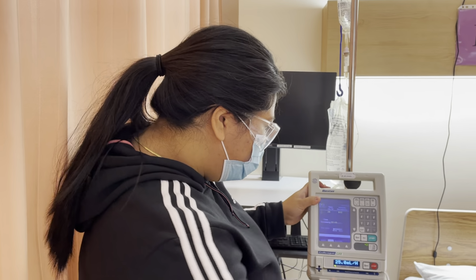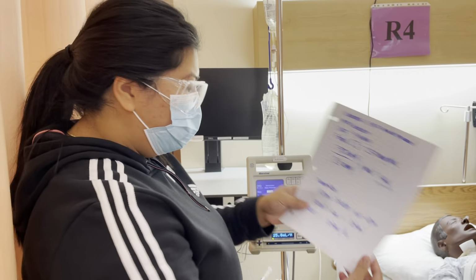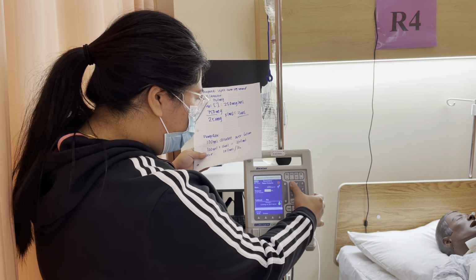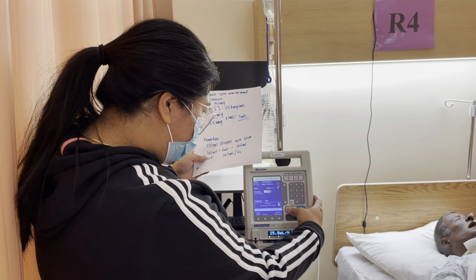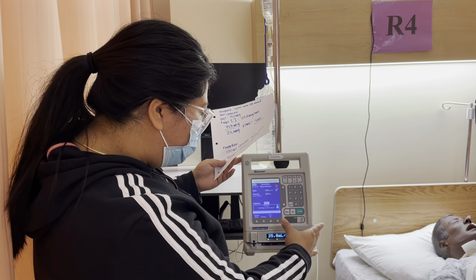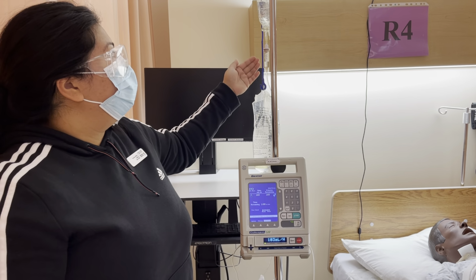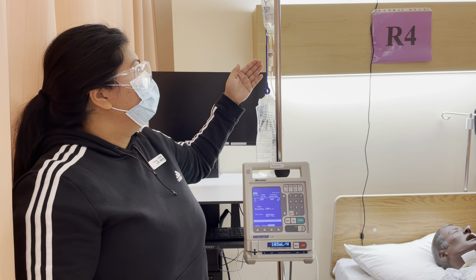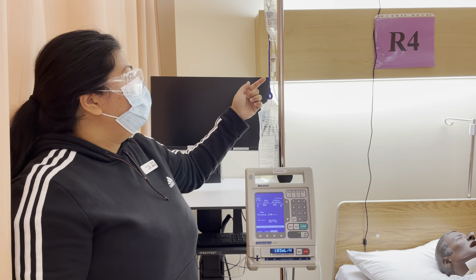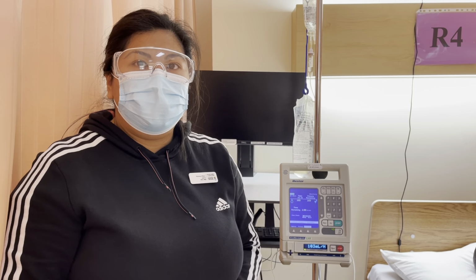So then we'll set our pump, the secondary, and our rate is 103 ml because we want it to run for an hour. We're gonna enter in 103 ml. And then for callback, we're gonna hit yes, confirm secondary, and then start. And then you see it's gonna run for an hour. We want to observe for at least 3 drops from our chamber. And then before I leave the patient's room, I'm gonna do an exit safety check.